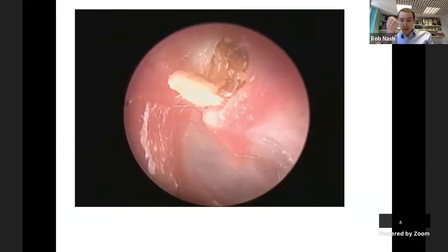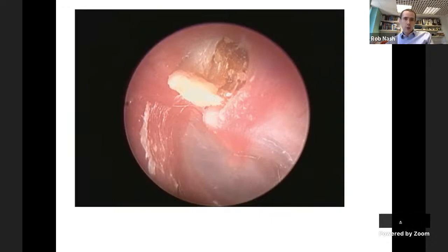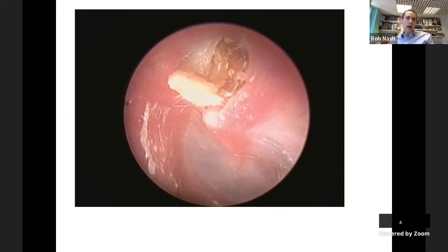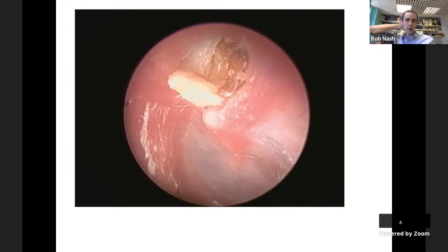This case is rather different. The pars tensa looks intact but the pars flaccida has a plug of wax. Wax isn't normally formed in the medial two-thirds of the ear canal - it has to be pushed there. So this wax may have been pushed there, but equally it could be dead squamous tissue with cholesteatoma arising from a classic location beneath it. You'd have a very low threshold to request CT to check for significant bony erosion indicating cholesteatoma.